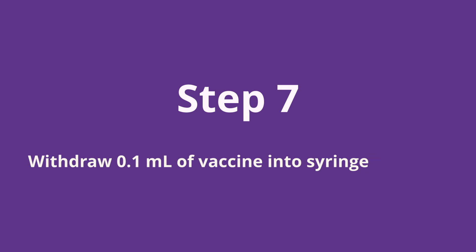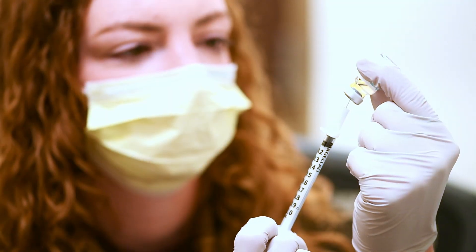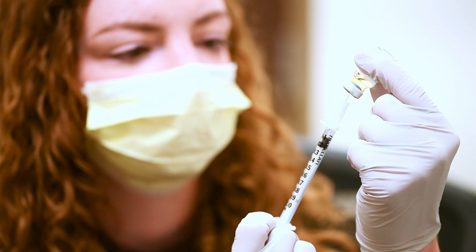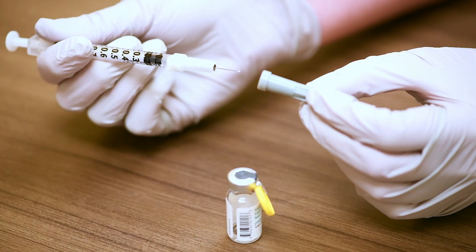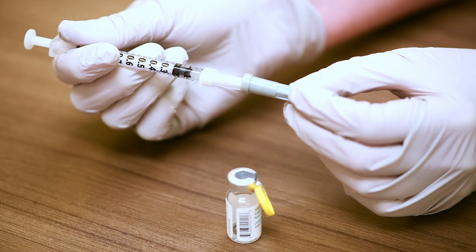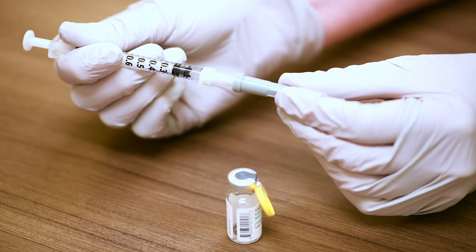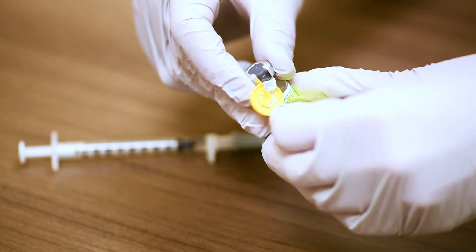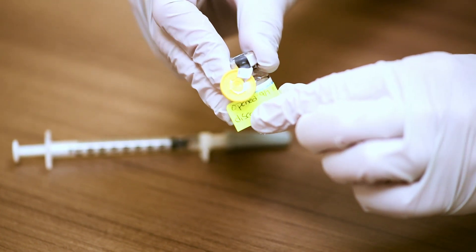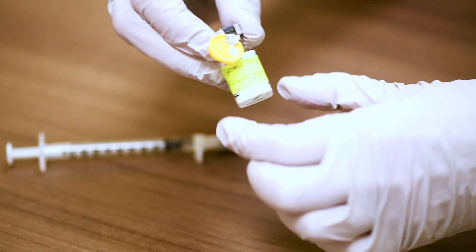Step seven: slowly withdraw 0.1 milliliters of Jynneos vaccine into the syringe. For new vials, note the date and time the vaccine was first punctured. Once the vial is punctured, you must discard it after eight hours. In our clinic, we use a small piece of tape or label to note the date, time the vaccine was opened, and the discard time, and adhere that to the vial.